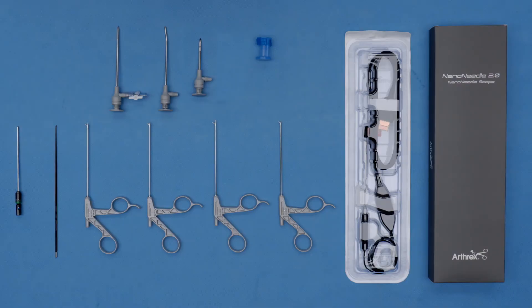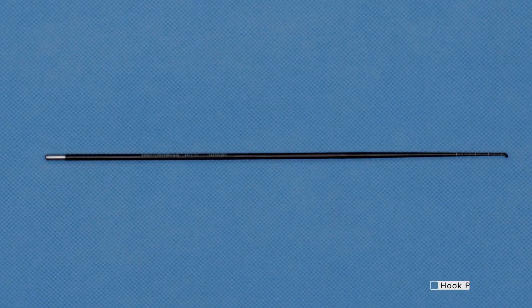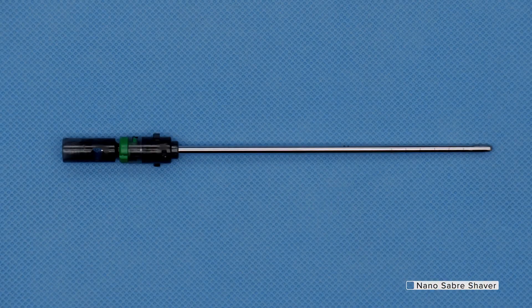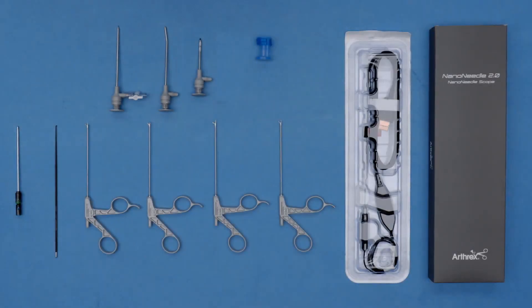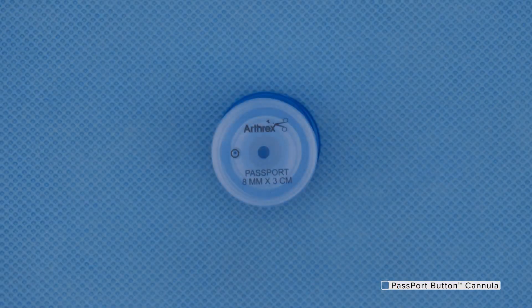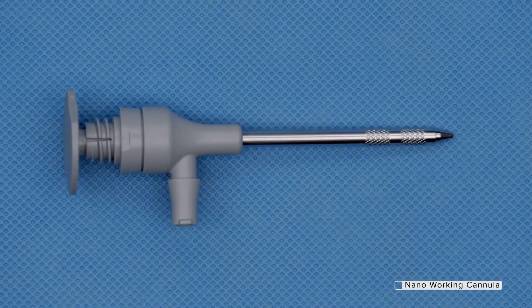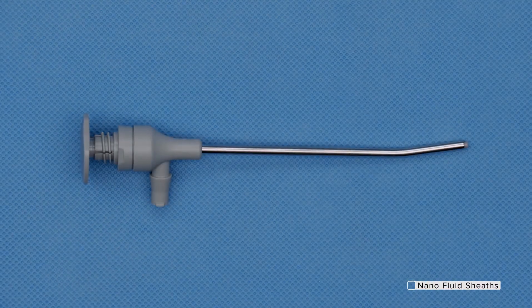Moving forward from the Grasper on the left side, we have this small hook probe and then the Nano Shaver. Most exciting thing of the day for me is this new Auxiliary Lumen Passport Cannula. It's an 8x3 passport and it has this auxiliary lumen that fits all of the Nano instruments — both the Grasper, Suture Retriever, et cetera — as well as the camera. Next is the standard working cannula and then the fluid sheaths, curved and straight.